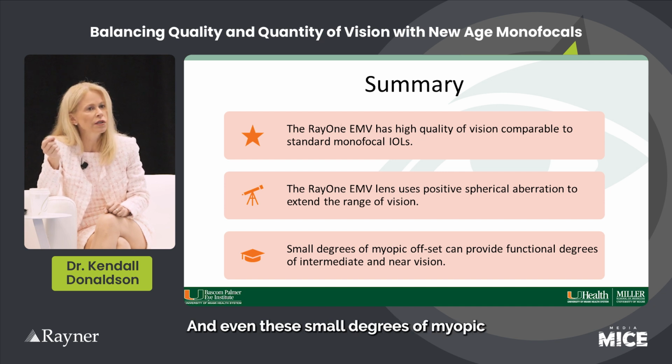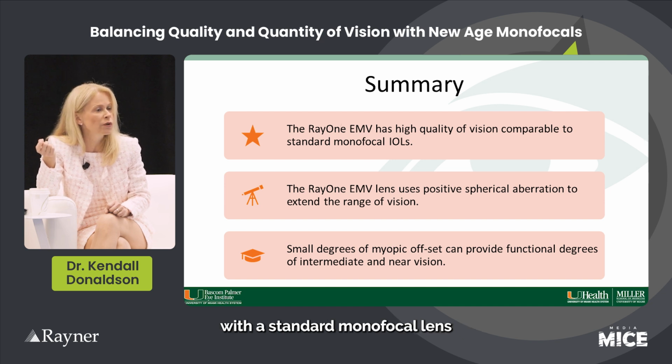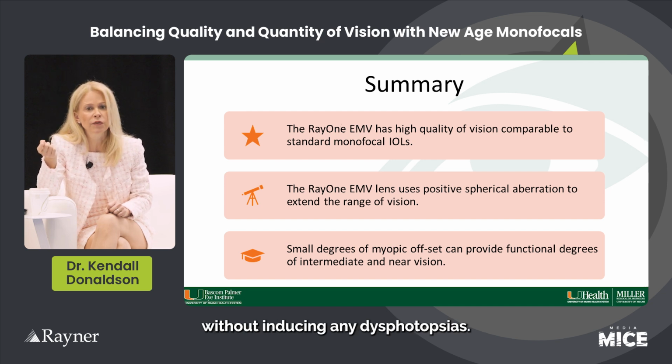And even these small degrees of myopic offset for the non-dominant eye really increase the range, really 3 times more than you would expect with a standard monofocal lens, without inducing any dysphotopsias.